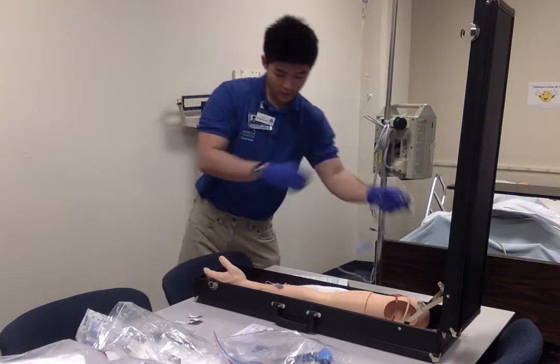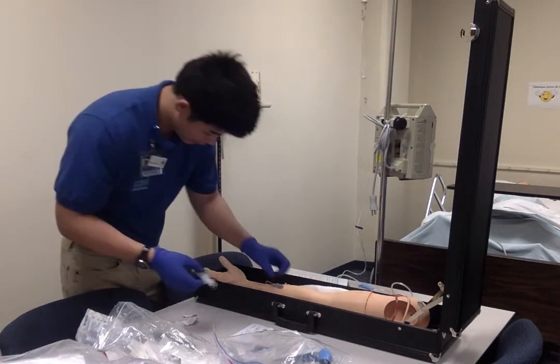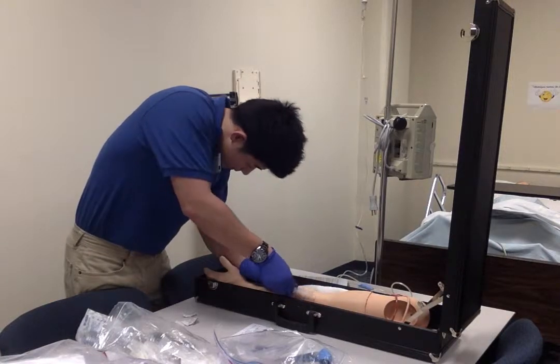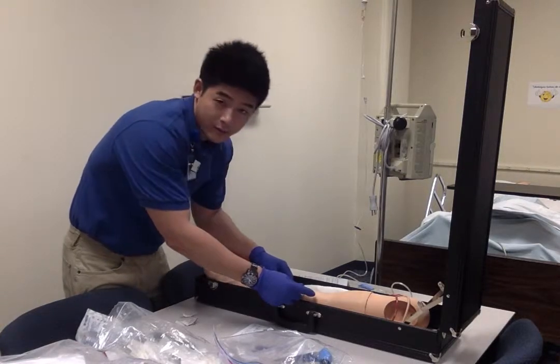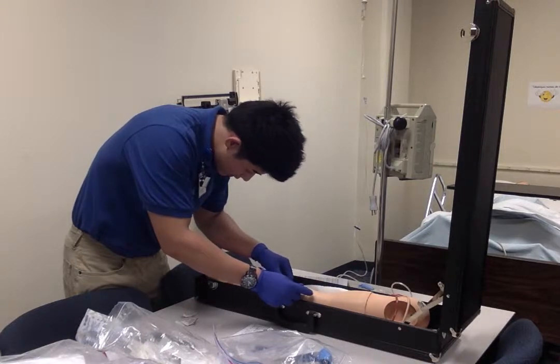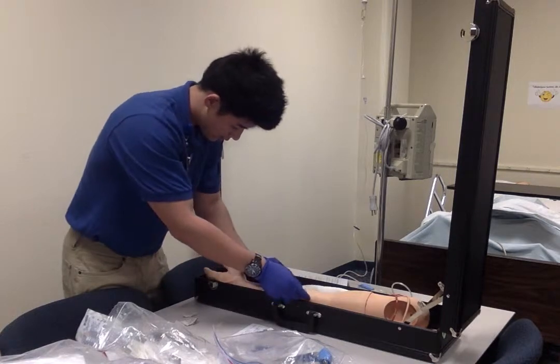Leave that to the side, and go ahead and do saline fluid again. Good. Going by 0.5 milliliter increments. Going in. And apply positive pressure and lock. Take this off.